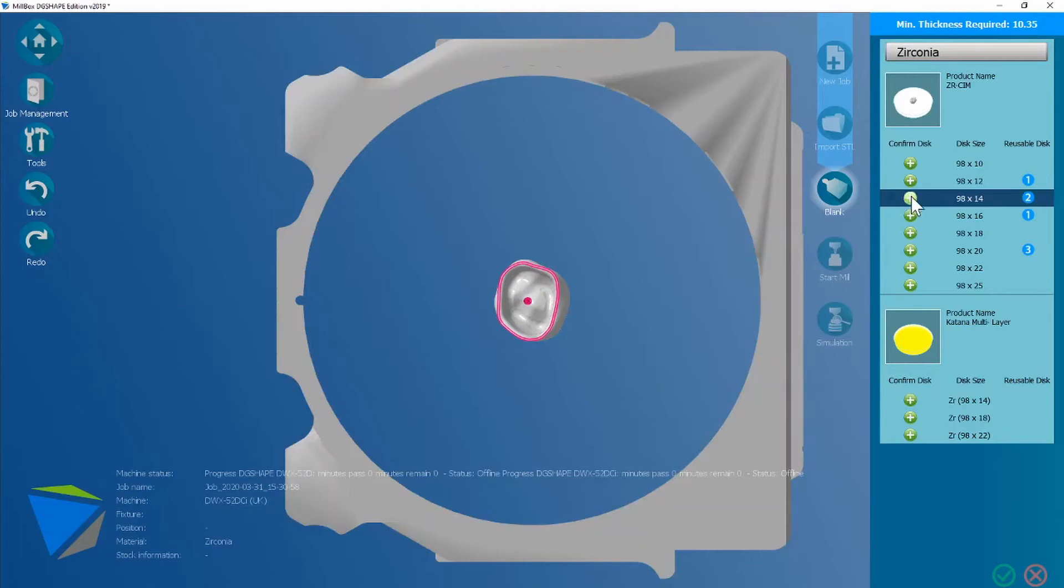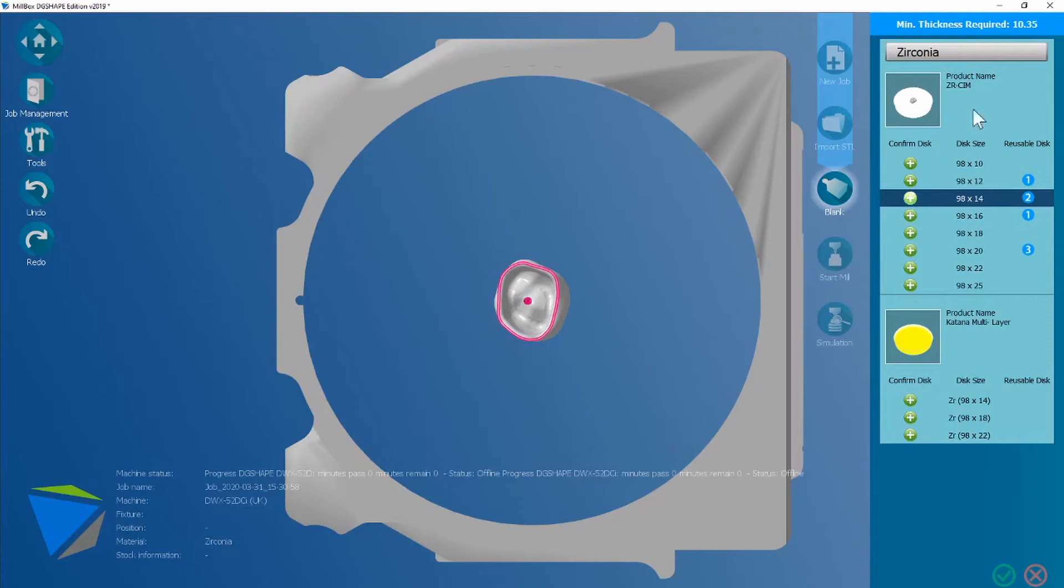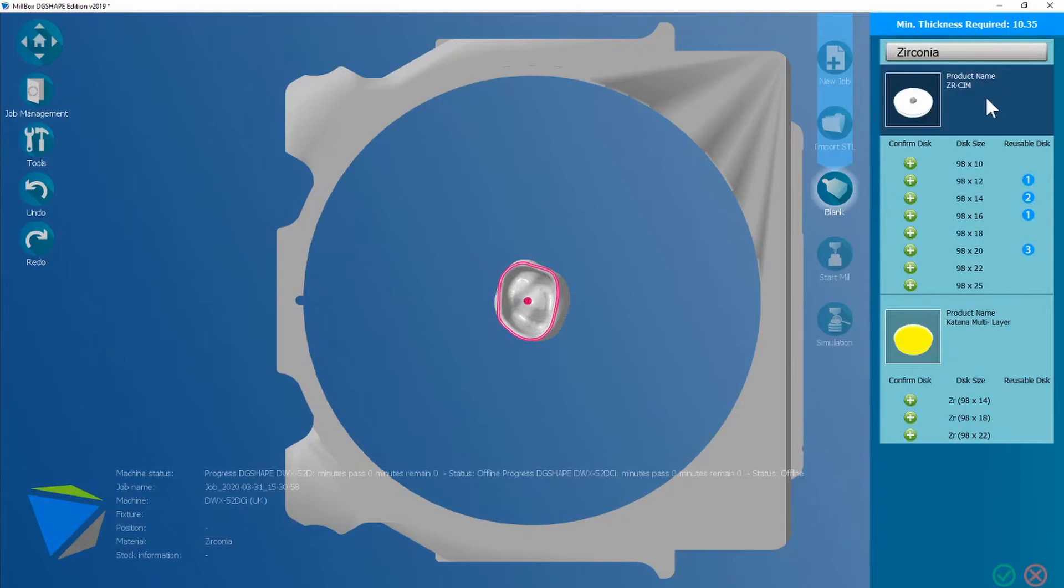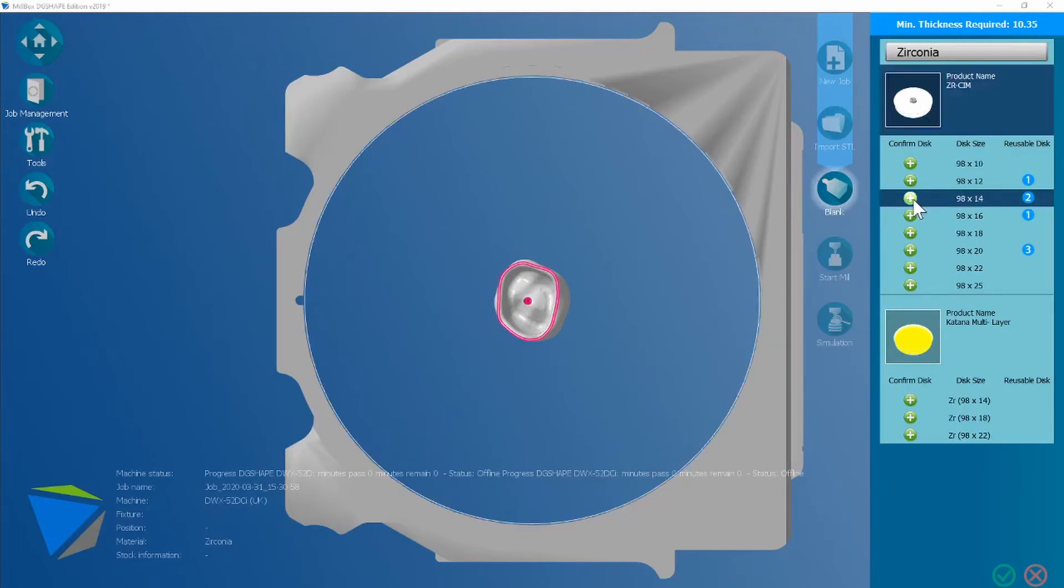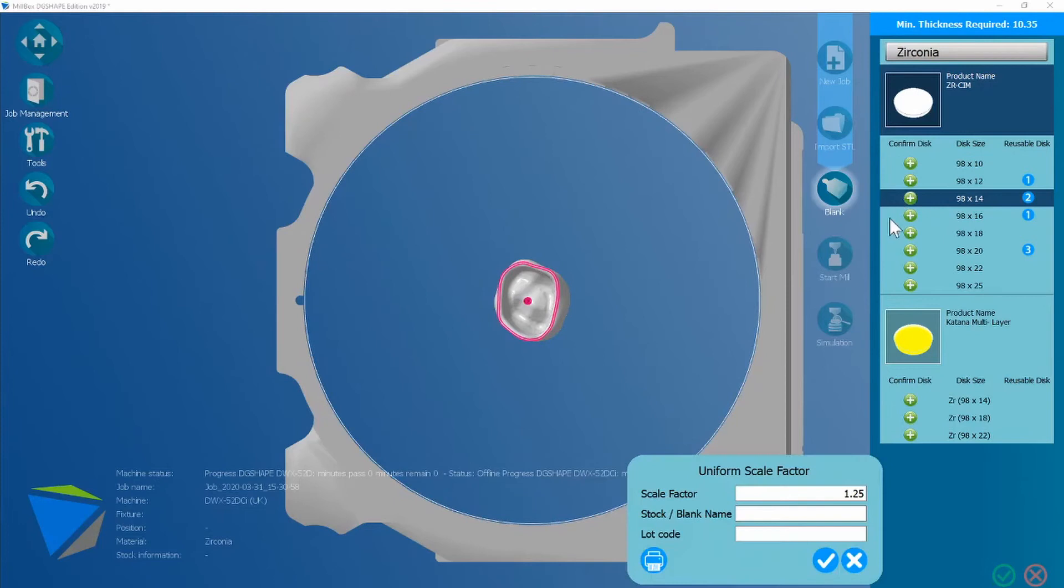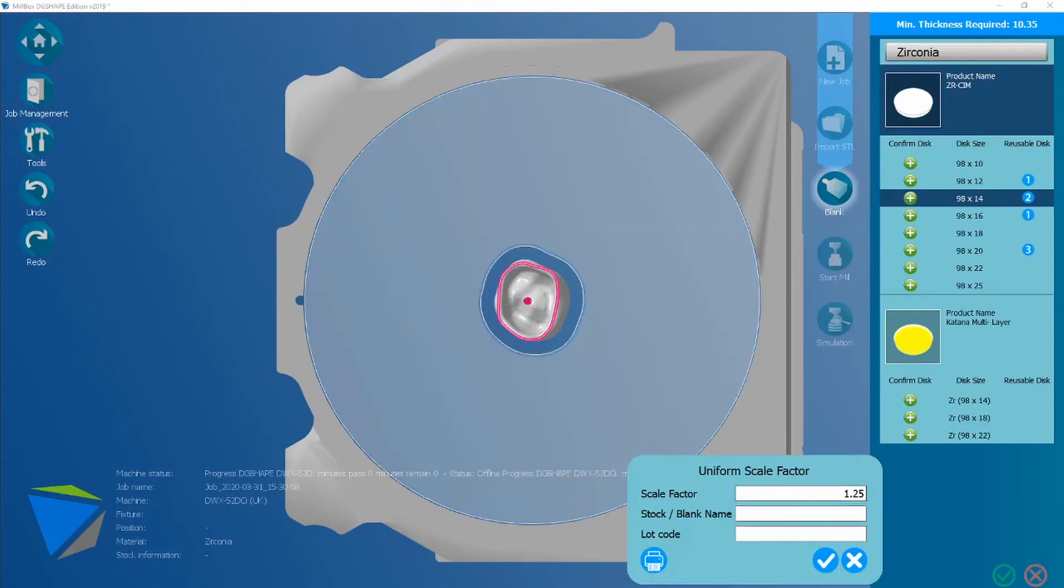We can either select a pre-existing disk or a new disk. As you can see from the top right, the minimum thickness required is 10.35 mil. I'm going to use a 14 mil disk and I'm going to select a new disk. The scale factor should be on the side of a disk.